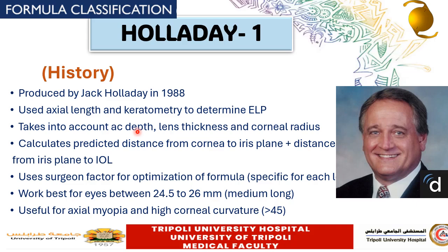This formula was found to be very useful in a wide range of axial lengths, and also in cases of high myopia or very long axial length, and cases with very steep cornea, more than 45 diopters.